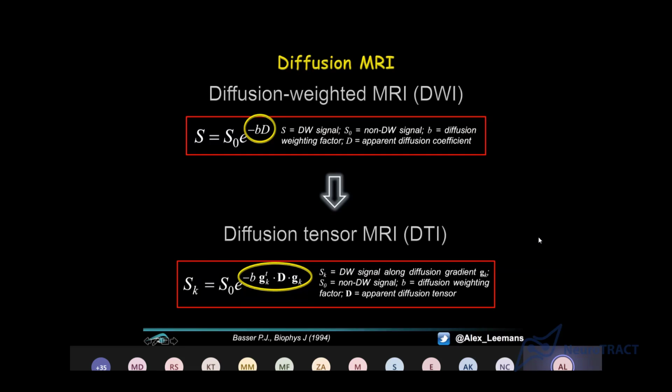Just to give you an idea, when I started my career, my research, I started from the diffusion tensor framework. So I kind of owe my career to this development. But, having said that, it's kind of weird, because I could even say I owe my career to the person that invented the computer because I use computers for my work. So anyway, the point I want to make is it was a major leap in diffusion imaging and in MRI in a way. Okay, now I'll give you a bit more detail about this diffusion tensor framework.